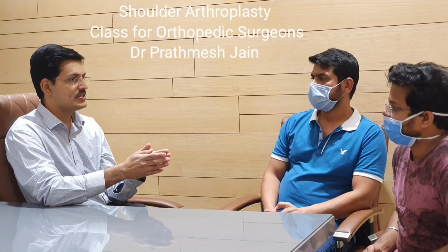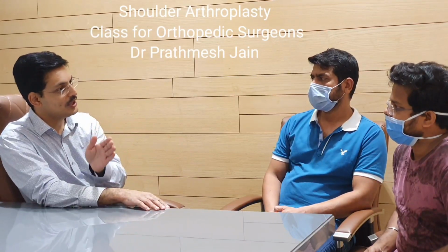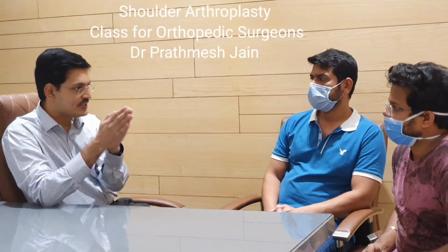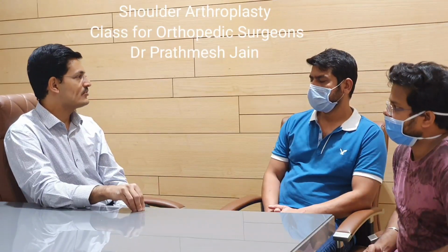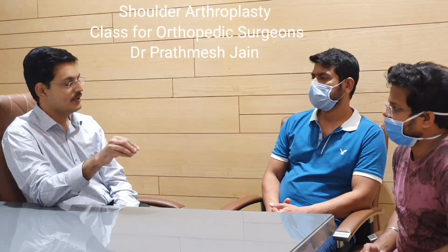Specifically, total shoulder arthroplasty is relatively recommended for a younger population as compared to an older population. In all the rest of the scenarios in the present era, reverse shoulder arthroplasty is the final choice.